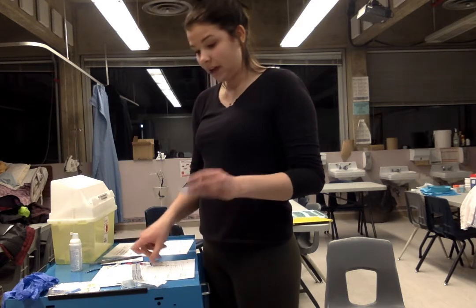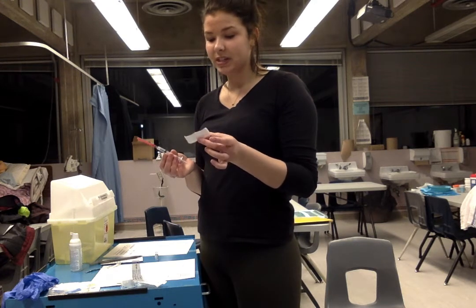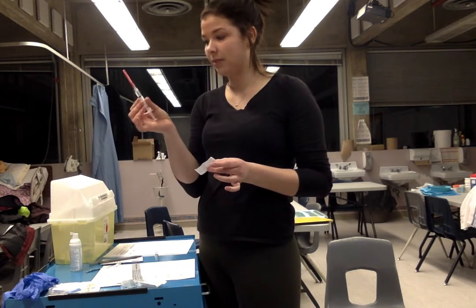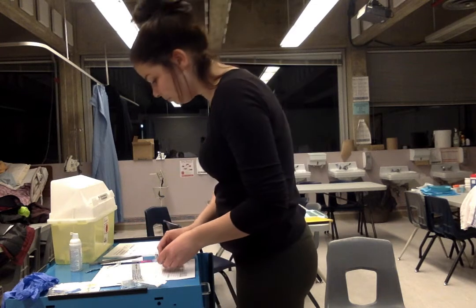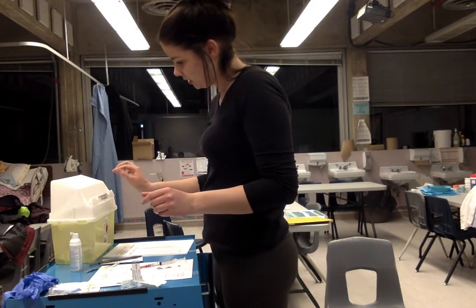Now I can do my third check from my label to my syringe. So we have morphine 10 milligrams per ml, and then we have morphine 10 milligrams per ml. All right, so now we can just make sure it's all the way.